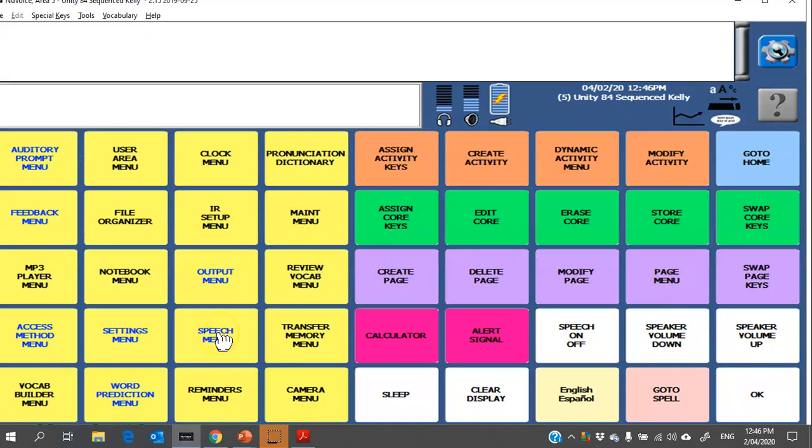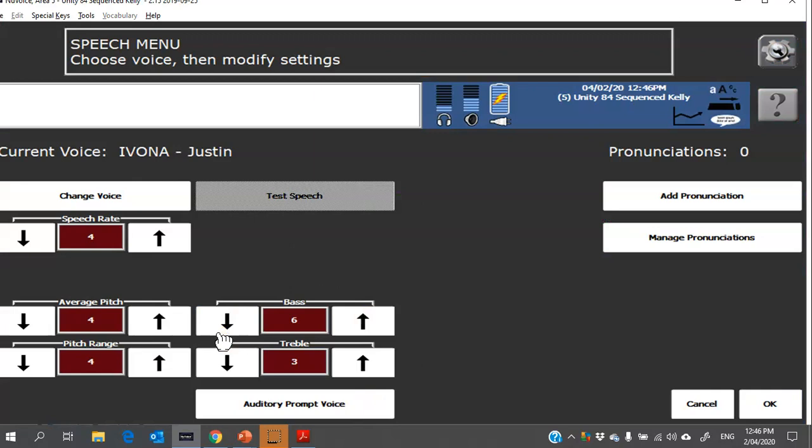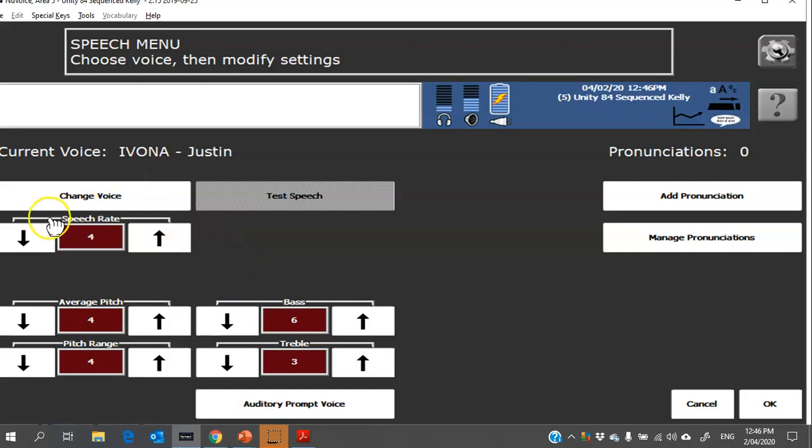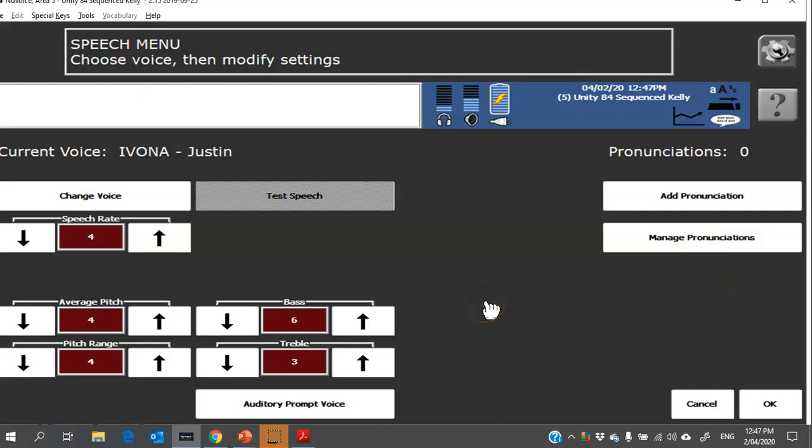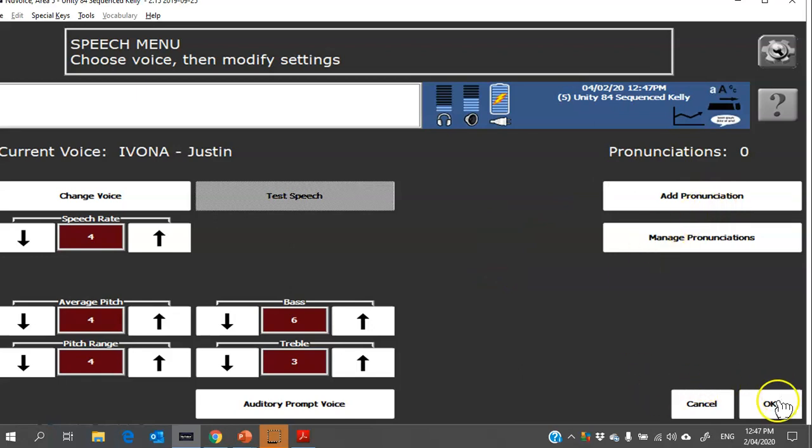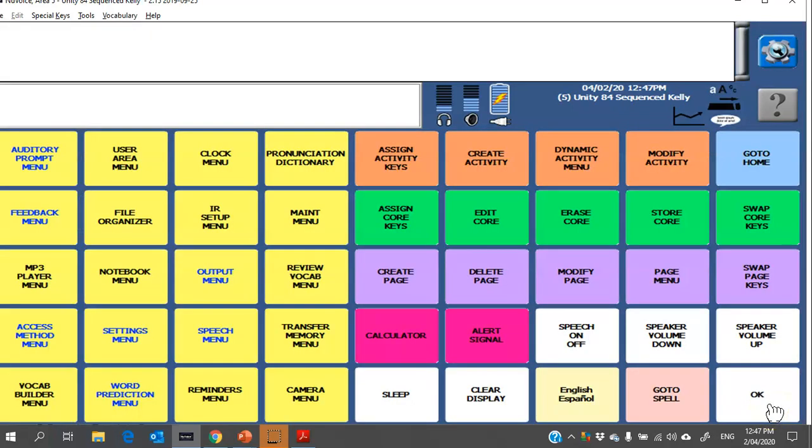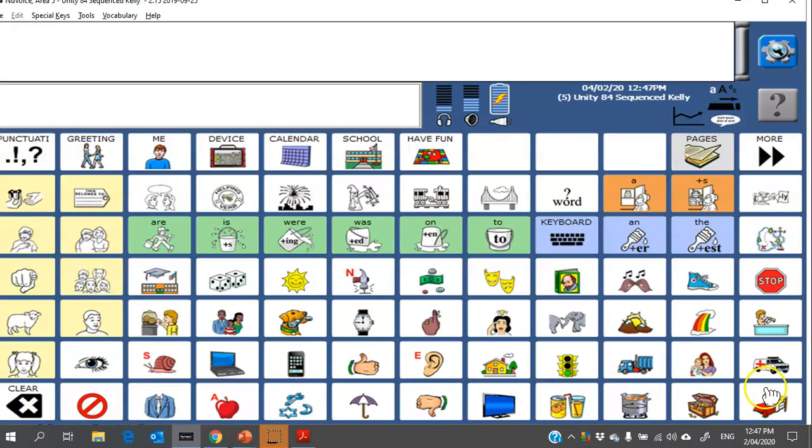Next, if you want to change the voice, you can go into speech menu and then you can choose change voice to explore the range of voices available on the device. Here you can also change the speech rate to make it faster or slower. On this side you can see there's a menu for adding pronunciations. If you find that the device is saying, for example, a person's name incorrectly, you can head in here and add a pronunciation so that it will say the word correctly.